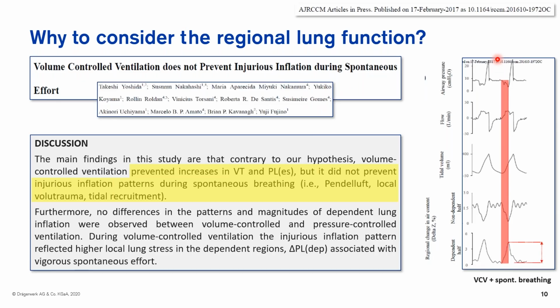And if we look at a very interesting publication in which a Japanese study group looked at volume controlled ventilation and whether this can prevent injurious inflation during spontaneous efforts, they came to the conclusion that volume controlled ventilation prevented the increase in tidal volume, obviously because we have a strong volume target.